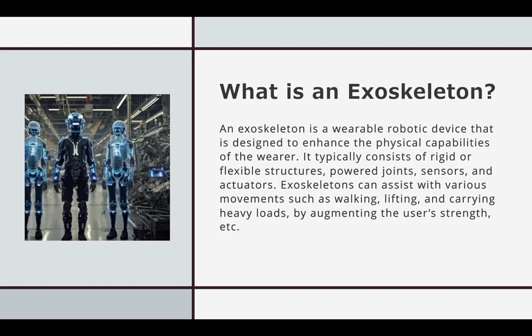So first things first, what is an exoskeleton? An exoskeleton is a wearable robotic device that is designed to enhance the physical capabilities of the wearer. It typically consists of rigid or flexible structures, power joints, sensors, and actuators. Exoskeletons can assist with various movements such as walking, lifting, and carrying heavy loads, and by augmenting the user's strength.